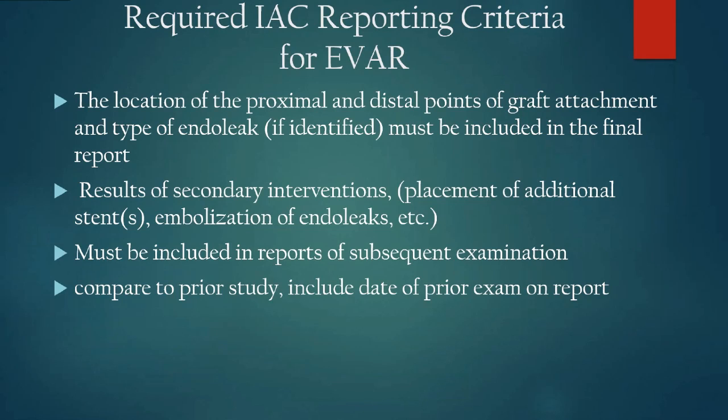So for example, this patient had embolization for a type 2 endoleak. That was a procedure. At the end for your reporting, prior exam noted endoleak. Today, successful coil embolization.